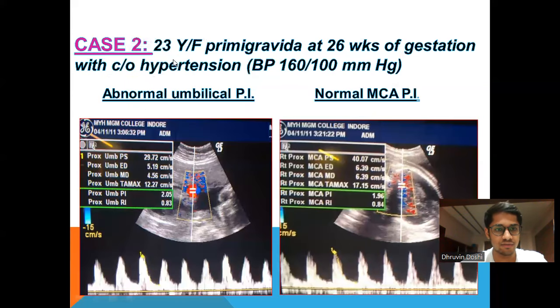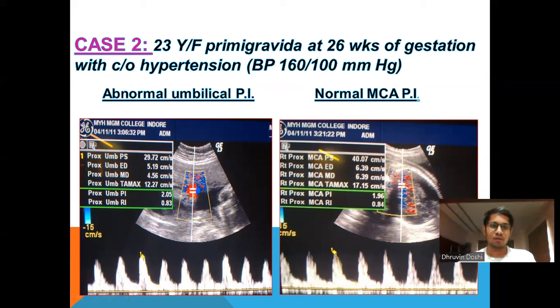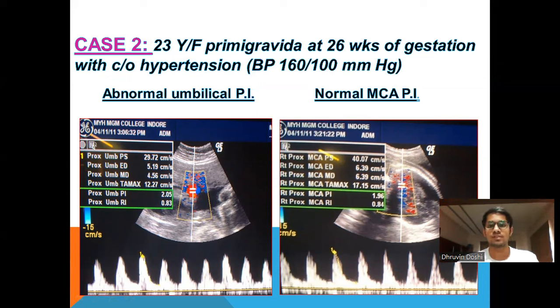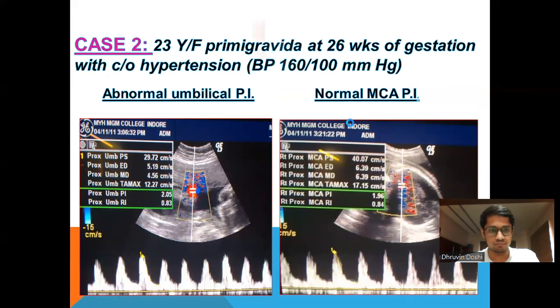The second case is a 23-year-old female, primigravida, at 26 weeks of gestation with complaint of hypertension. BP is 160/100 mmHg. The umbilical PI is raised, about 2.05. However, the MCA PI is normal.